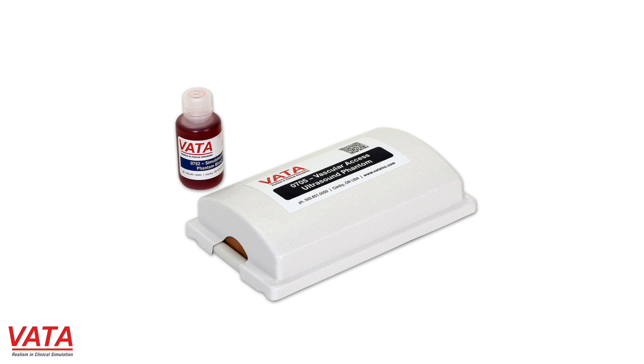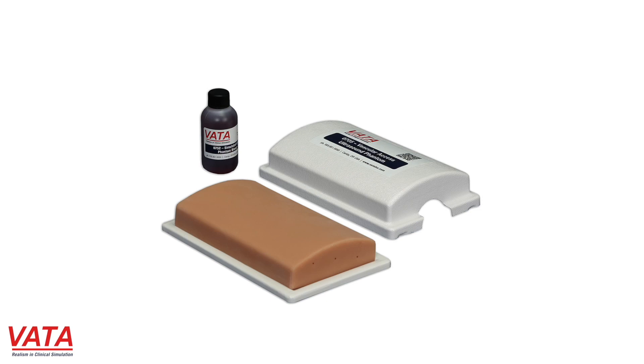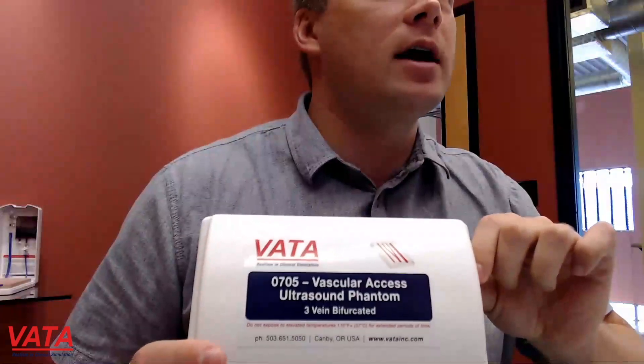This one here that we're going to show you today is going to be our 705. We actually have a couple of different versions of it, so if you're from one of the companies we work with, you might use a different model and we can definitely include information on that. This is one of our models — our 705 vascular access phantom.